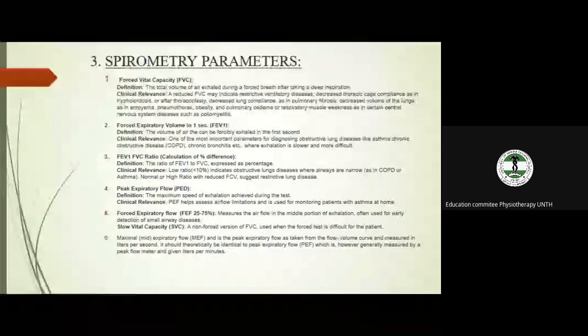We use it to notice patients with smaller airway diseases. That one measures the airflow in the middle portion of exhalation.